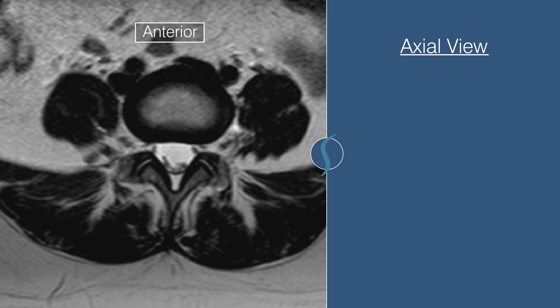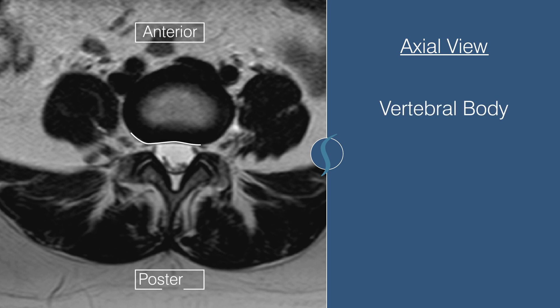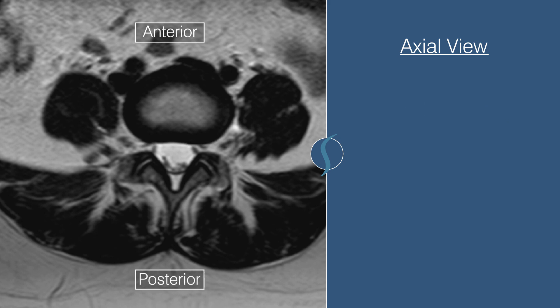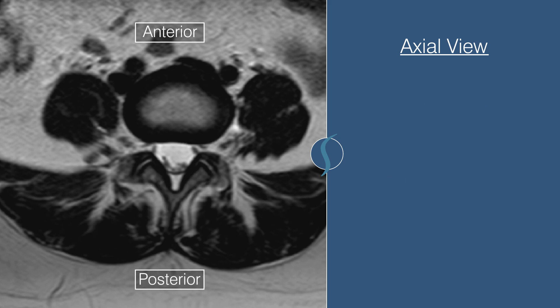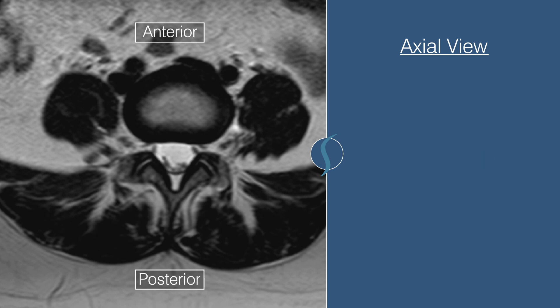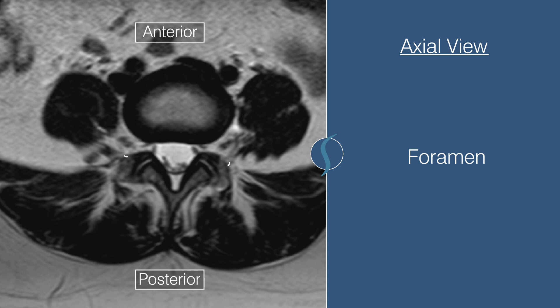Anteriorly, which means the front, there's a vertebral body. Posteriorly, or the rear, there are posterior spinal elements. In the middle is the round space called the spinal canal. Within the spinal canal, we can see individual nerves floating within the spinal sac, and the exiting hole for the nerves going down into the legs, called the foramen.